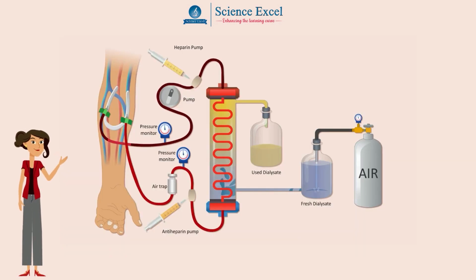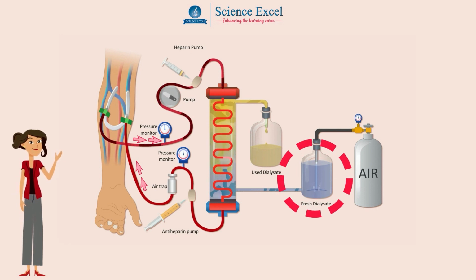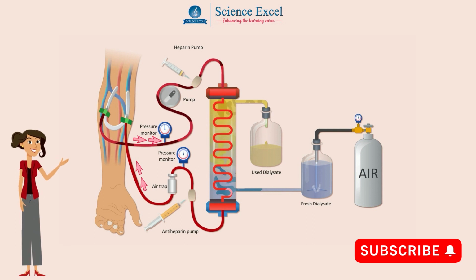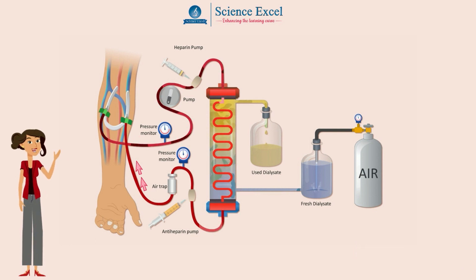The dialysis machine also has blood pumps with pressure monitors that enable easy flow of blood from the patient to the machine and back to the patient. It also has pumps for the flow of fresh dialysate and for the removal of used dialysate. The dialysate is also kept at body temperature to maintain homeostasis, that is, a stable condition in the patient's body.